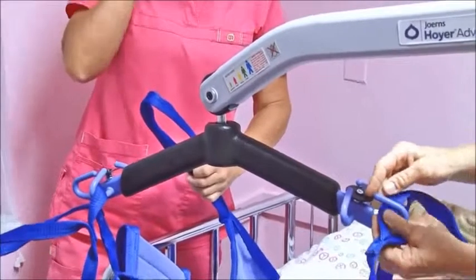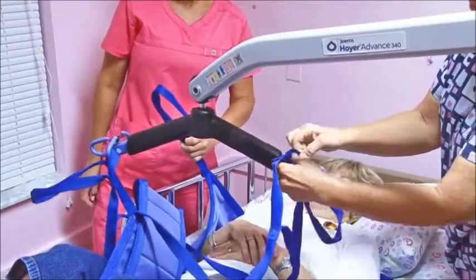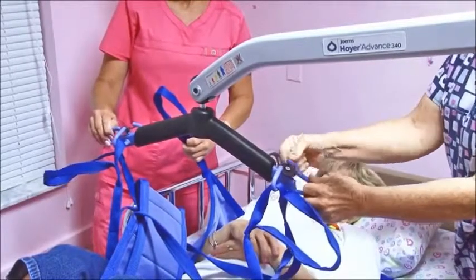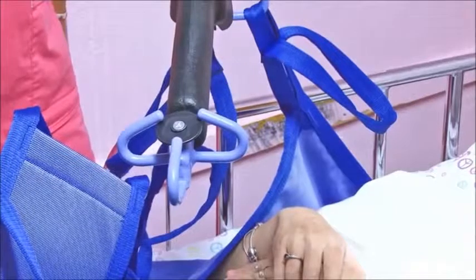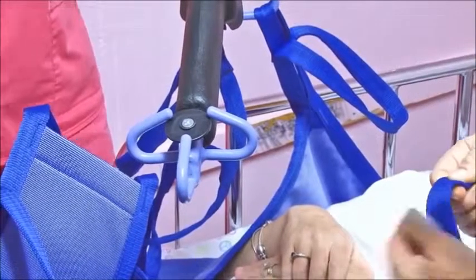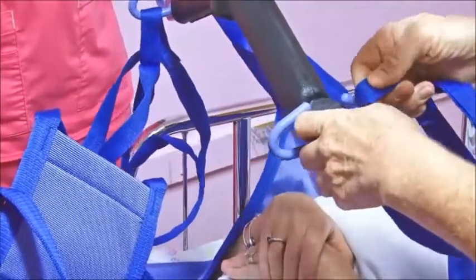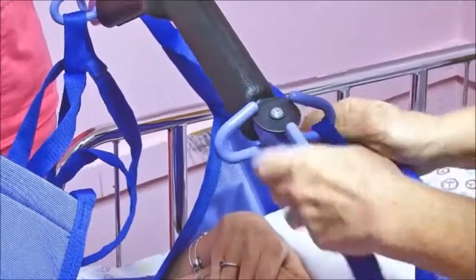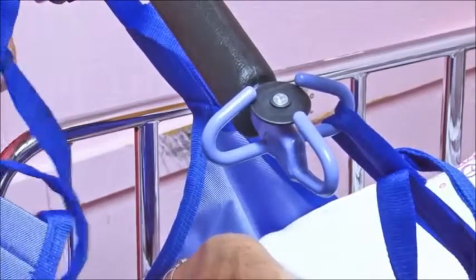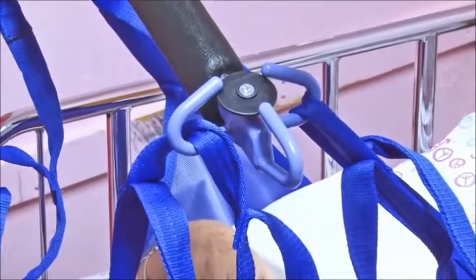And if the person that you're working with puts it on the center, that's the wrong position. They need to put it on the back section. The center is not going to be used in this case. We're going to use the same corresponding loop. She's on the first loop, so I'm also going to go to the first loop, and I have to place the tab down, and then we're in the middle loop, and now she's in the sling.